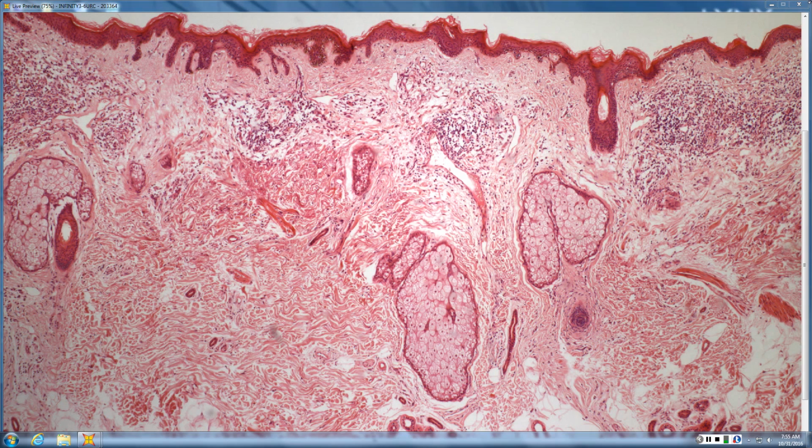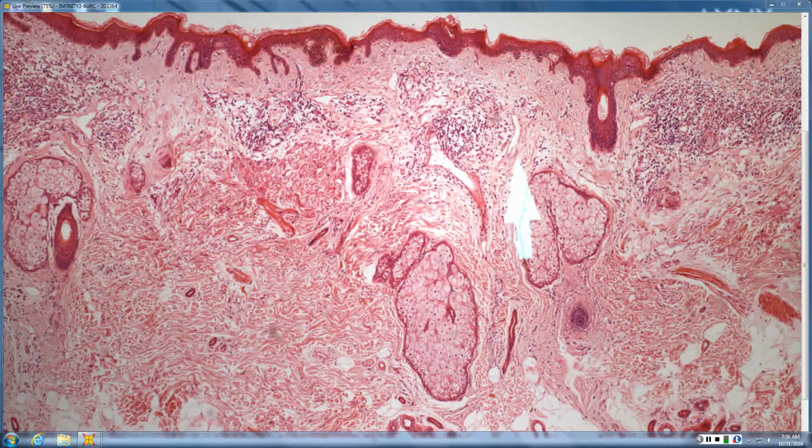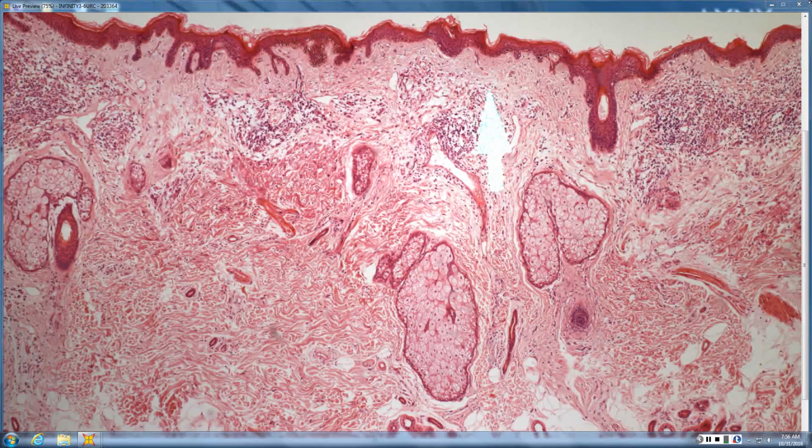Yes, ma'am. When I see a slide that's faded, it's often really hard for me to tell if there's dermal edema or if it's just faded. Is there a trick you have for knowing? Look for lymphectasia. If there's edema, you'll have dilated lymphatics. For instance, in this one at scan, you see these thin-walled, irregular vessels there, right? There's no papillary dermal edema. It's not a Sweet's pattern, but this was a little indurated, a little edematous, just enough to give you lymphectasia.